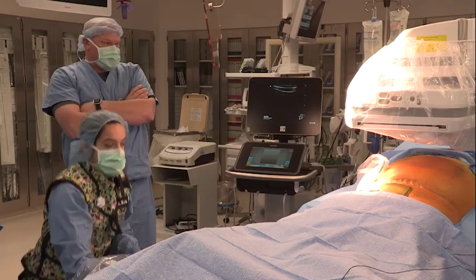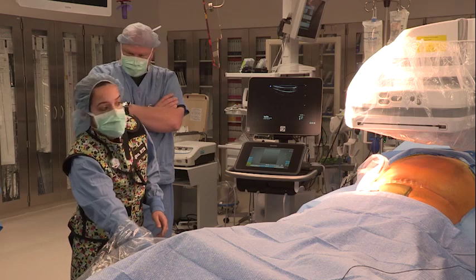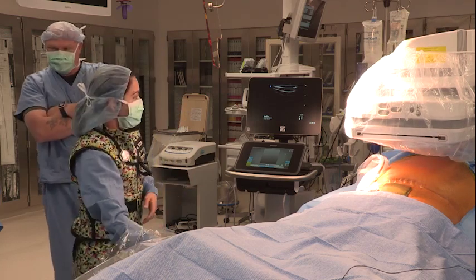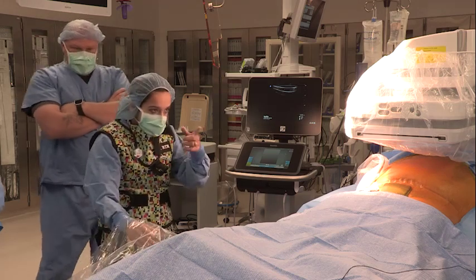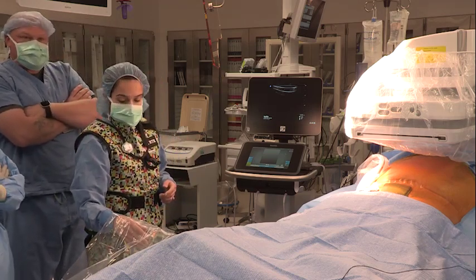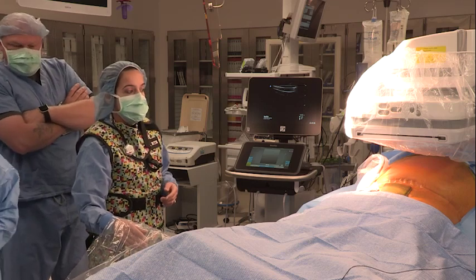The radiology technician will operate the C-arm, obtain supplies as needed, and help with IVUS playback and image capture. Additional radiology technicians may assist with the procedure or scrub in to help manage the wire or wires.